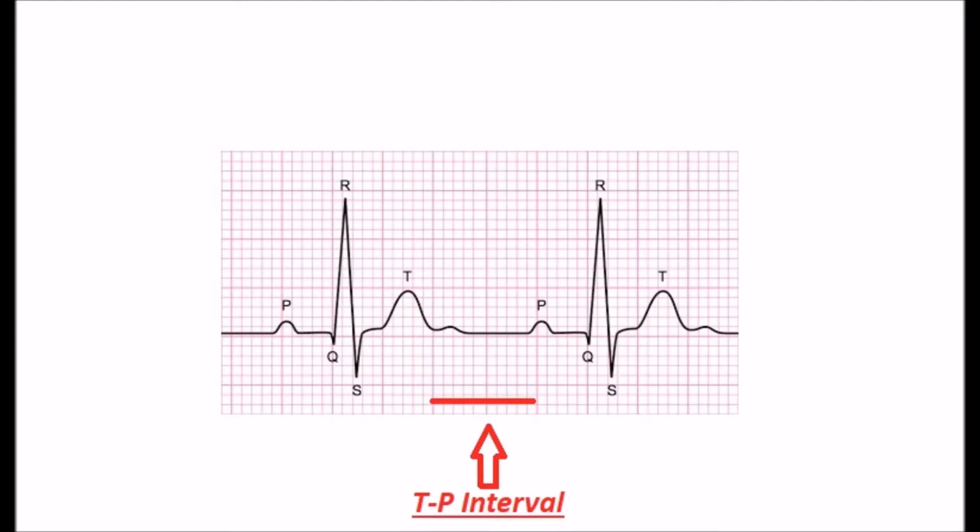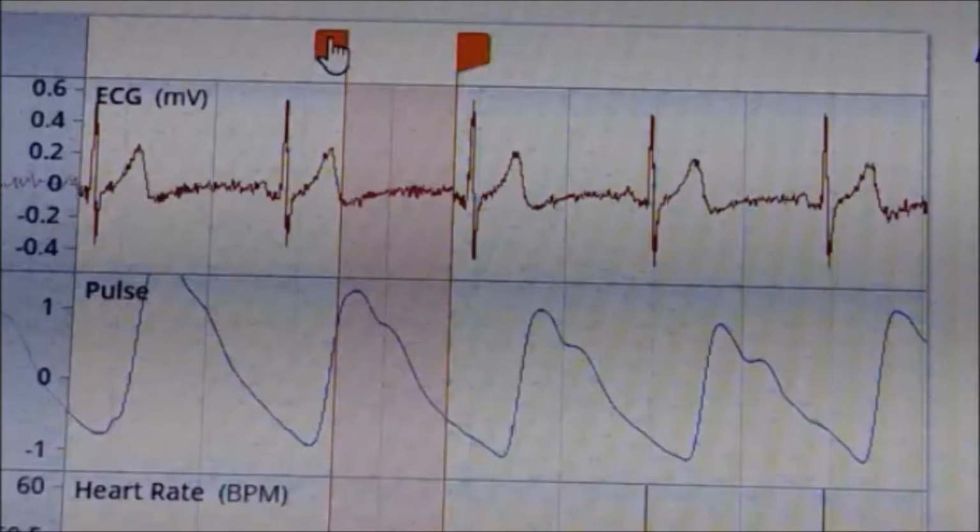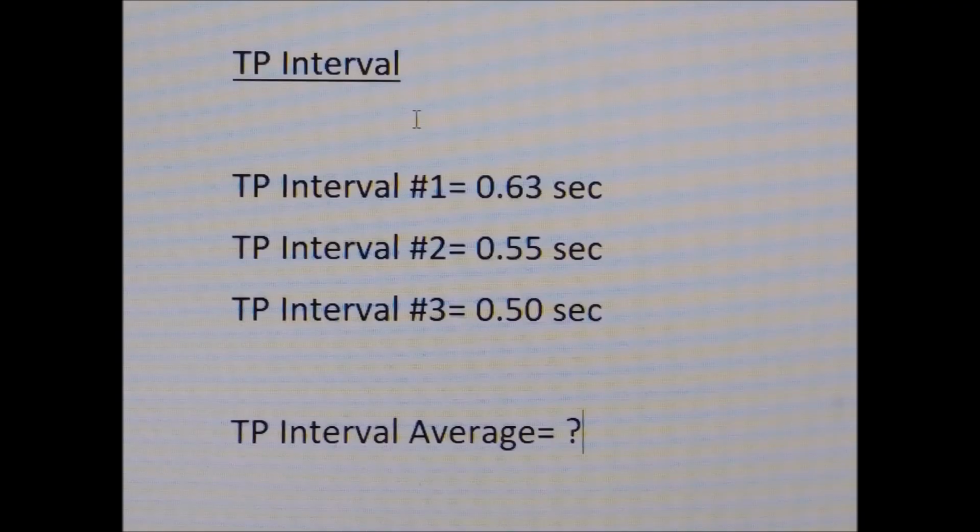Next, I'll be measuring 3 consecutive TP intervals, which spans the time from the end of 1 T wave to the beginning of the P wave in the following trace. The data for the 3 consecutive TP intervals is 0.63 seconds for the first, 0.55 seconds for the second, and 0.50 seconds for the third.